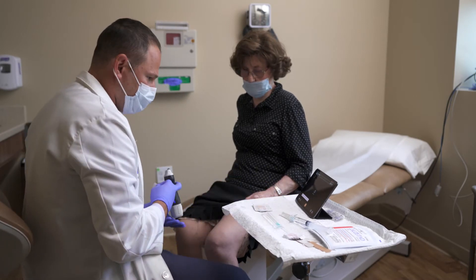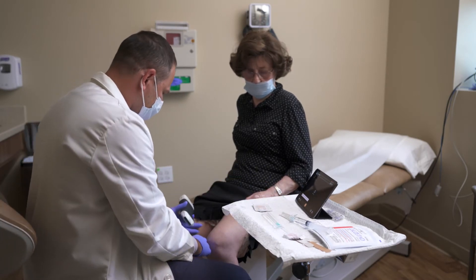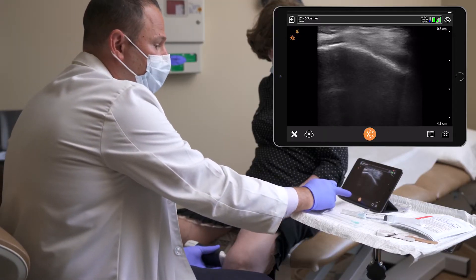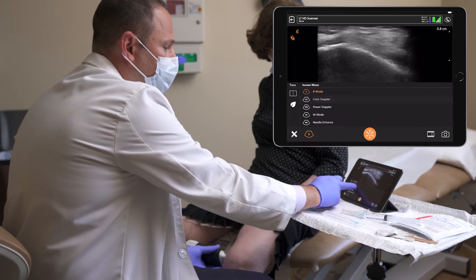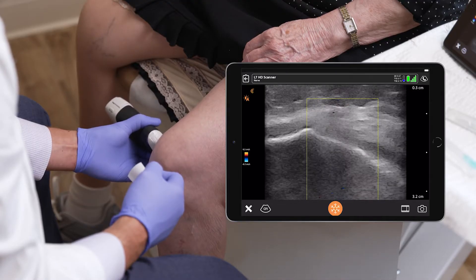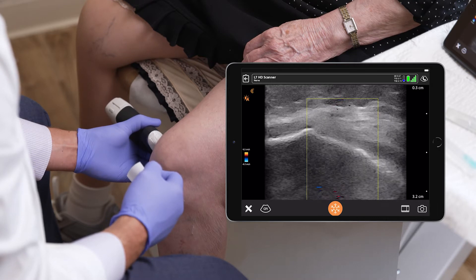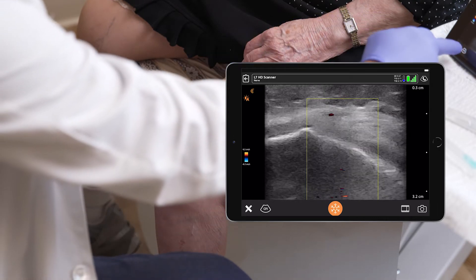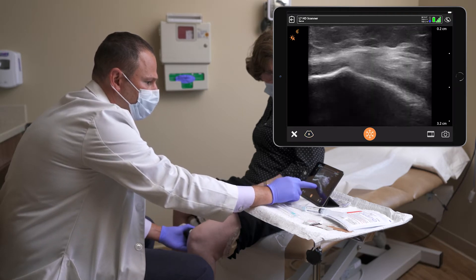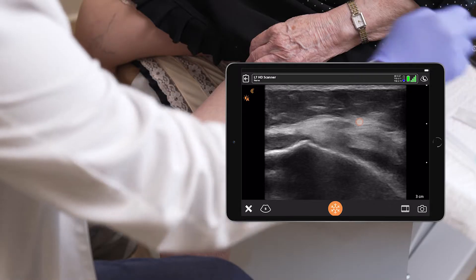Looking for the superior medial genicular nerve, I scan the medial side of the knee, putting on color Doppler. Scanning on the medial aspect of the knee, we can find the genicular nerve running along with the artery, close to the epicondyle. Take off the Doppler, and one can see the nerve next to the artery.